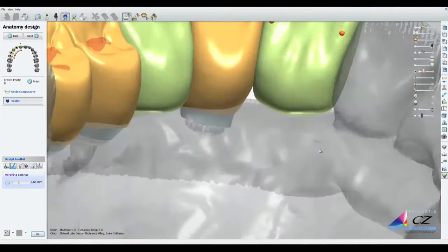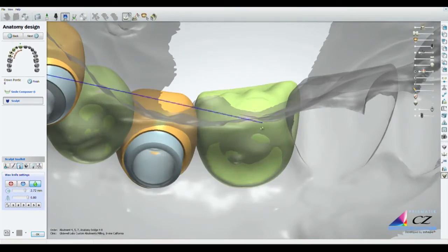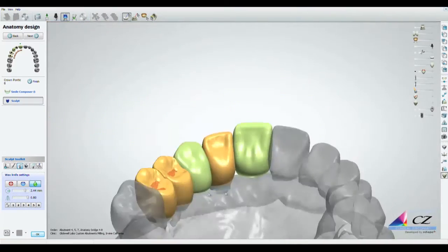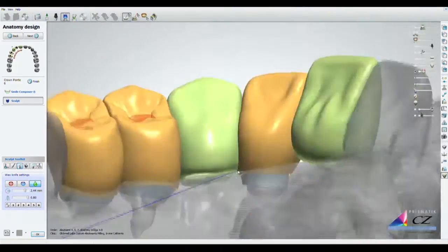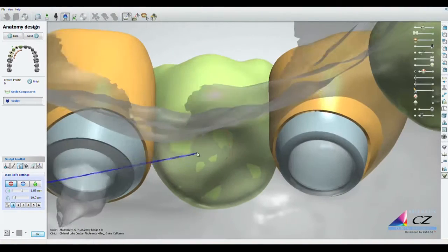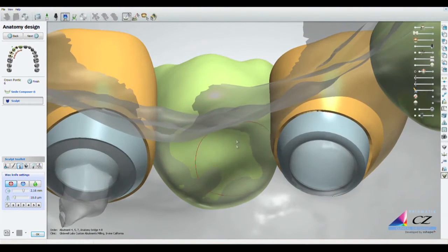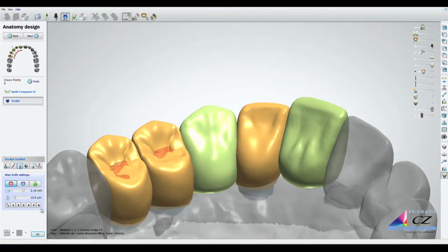Next, the margins are defined and verified. At this stage, we must consider many factors of the restorative design: size, shape, and dimensions, as well as the interproximal and opposing contacts for five adjoining crowns of the temporary prosthesis.